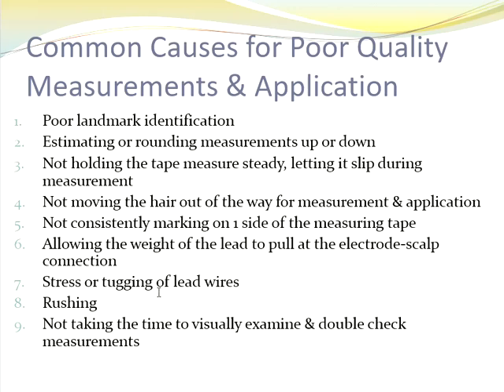Same thing with making sure that there's not a lot of stress or heavily tugging on the wires, anything like that. It's going to take some time to learn how to do this, and so I don't recommend rushing. I'd recommend really shooting for accuracy at first, and with time and practice, the efficiency at measuring and applying will come, but focus on being accurate first.